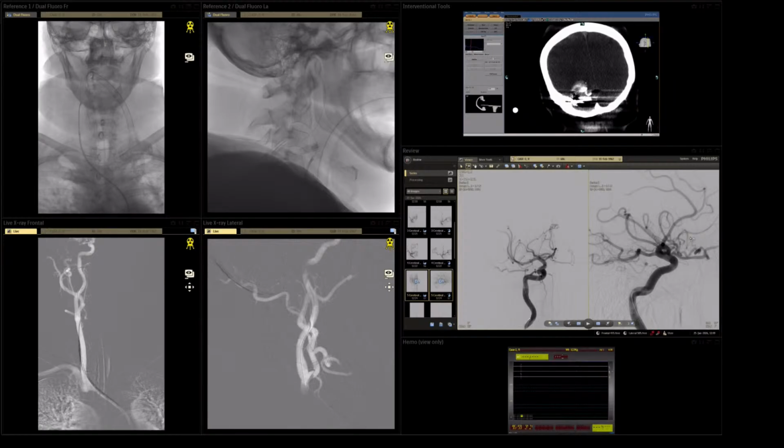We don't need to go to the maxillary artery. I think it's better to stay in the origin of the occipital. It's a lingual artery.